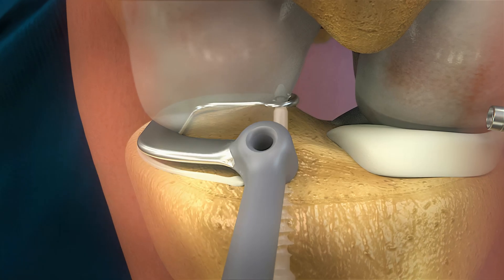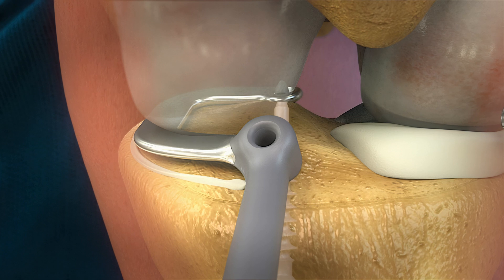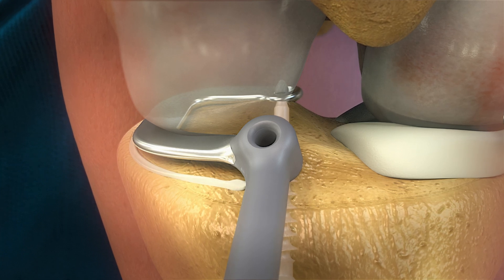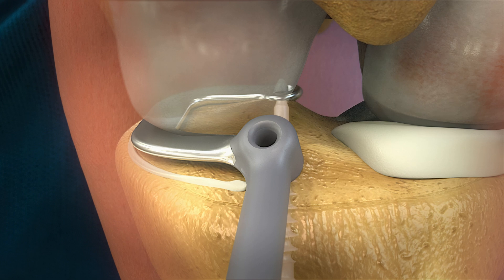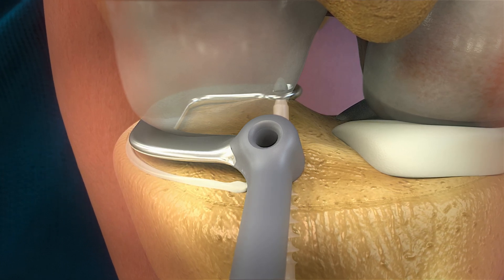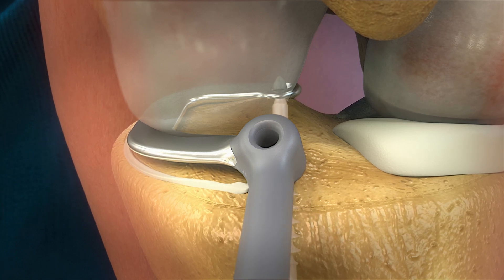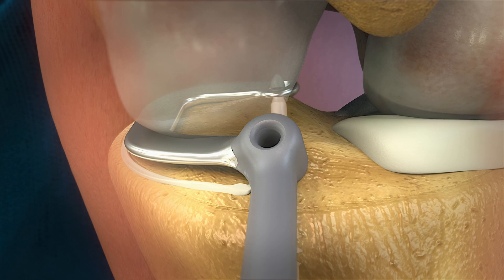With the ring of the trial sizer around the posterior screw head, the exact location of the anterior screw is determined by the trial sizer. At this stage, it is important to confirm the right location of the anterior drill hole. A more posterior location may lead to impingement of the anterior horn during extension of the knee.